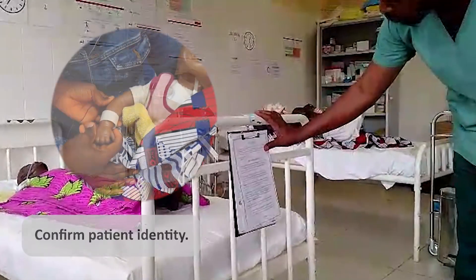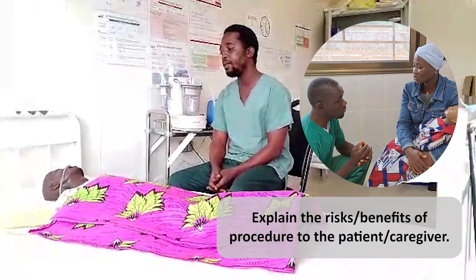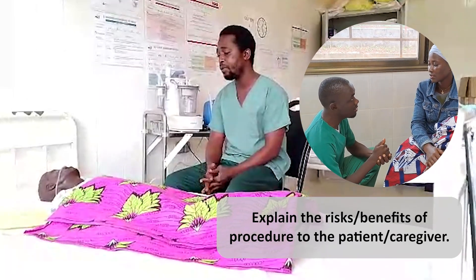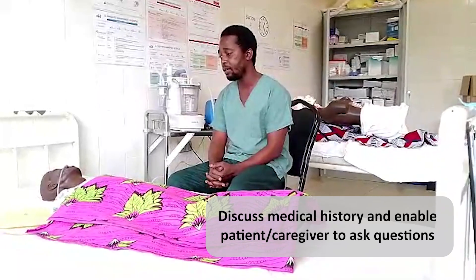When we go to the patient's bedside, it is important to first confirm their identity. Then, we should explain the procedure to the patient or caregiver in their preferred language. This gives the patient or caregiver an opportunity to discuss the patient's previous medical history and ensures that they can ask questions or voice any concerns.